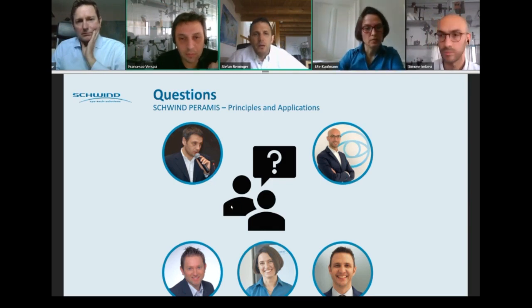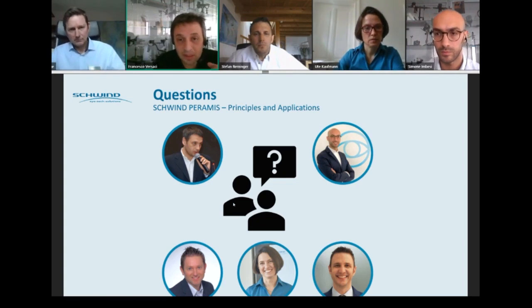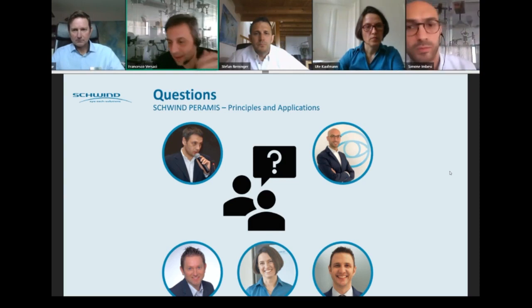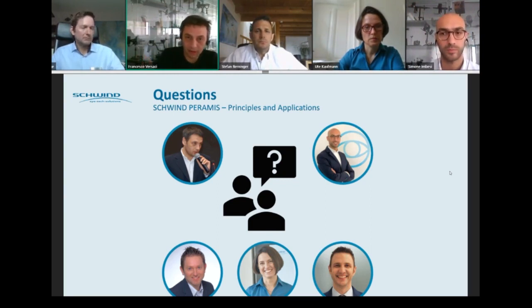Just one. It's not like the tracing that projects many spots together, but since we have a second plane that images the pupil, I would need to go back to the presentation, but the optical design is such that everything is mixed up on the pyramid, but it gets separated on the CCD plane and on the pupil plane.